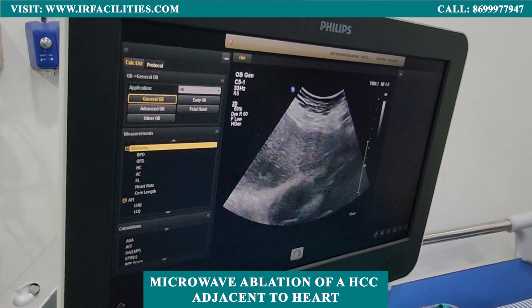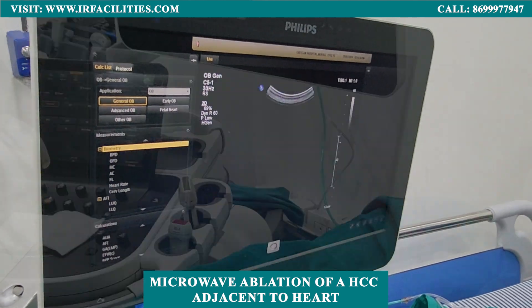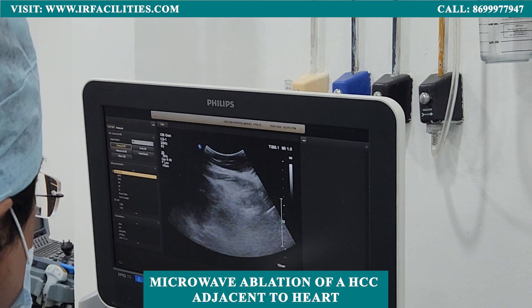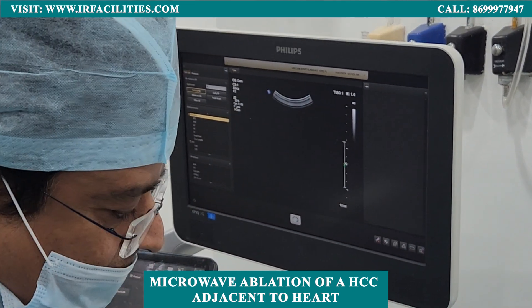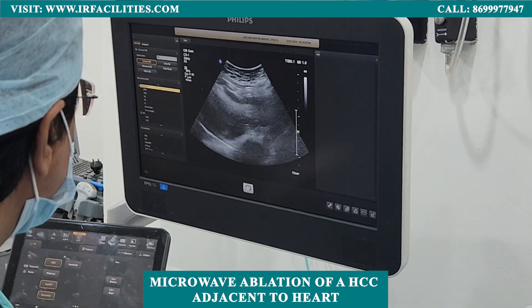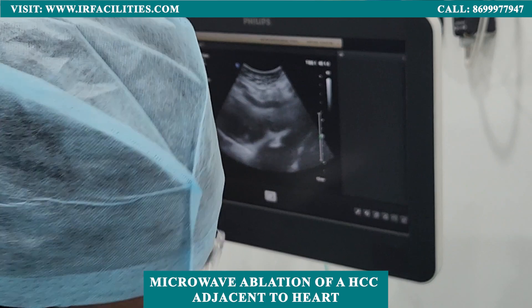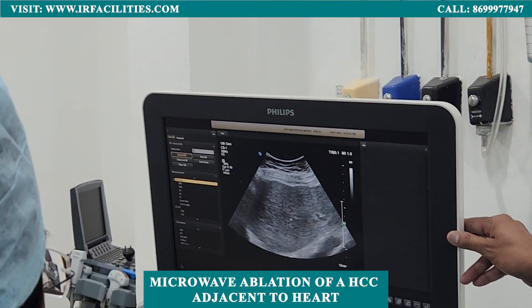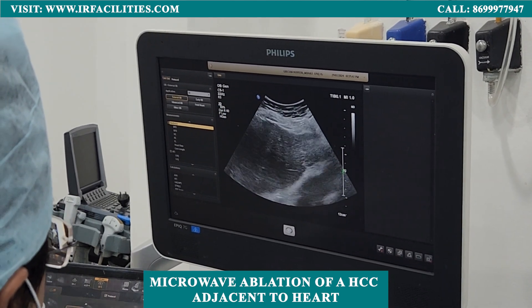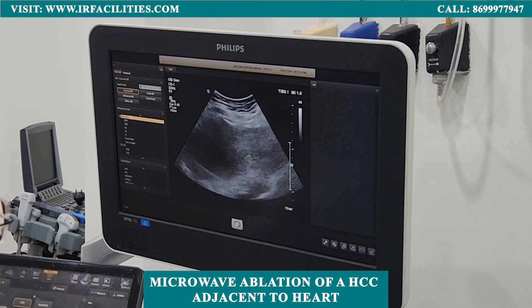So let's give a little local, so that she operates. Good. Now, you can't see it now.